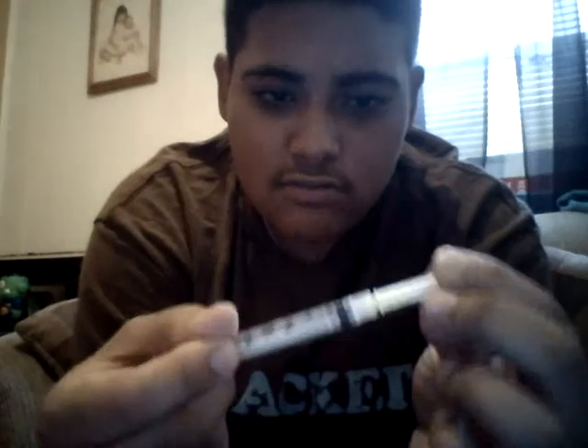Then you get your syringe. It already comes with a needle, so you don't have to put it in there or anything. It's a pretty thick needle, but we won't be sticking this in my leg, so whatever.